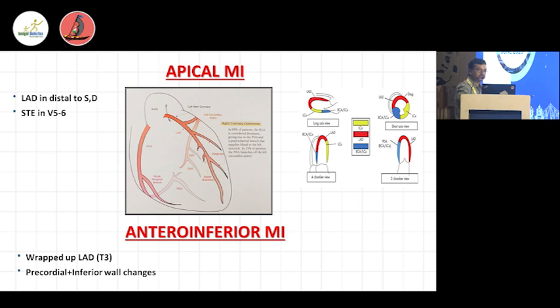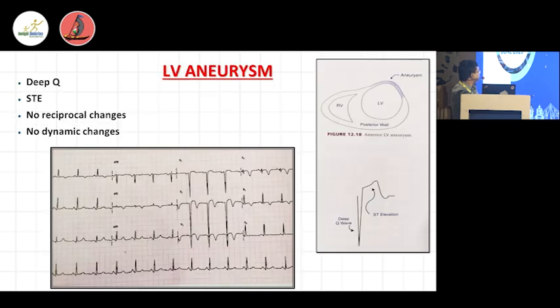So ultimately there are 12 ECG leads we all know. The reflection is like this. The inferior-looking leads are 2, 3 and aVF, so we get changes related to the RCA here, and if it is a left dominant circulation, then the circumflex will also be reflected here. The high lateral leads are 1 and aVL. Here we get changes related to the LAD, diagonal, and OM also.